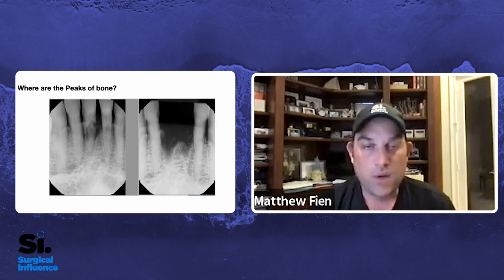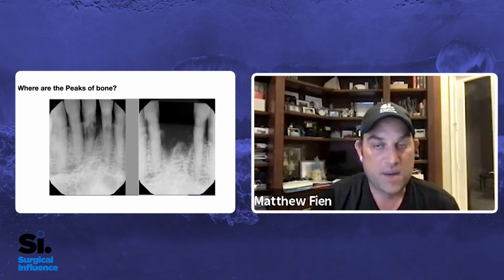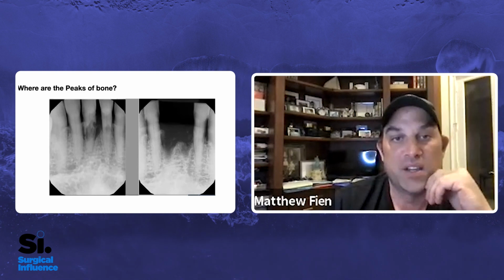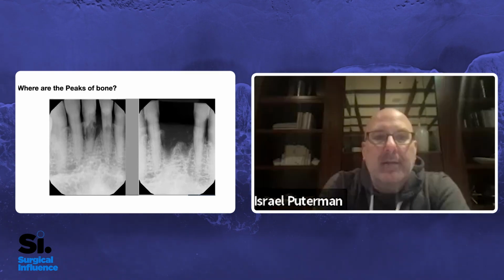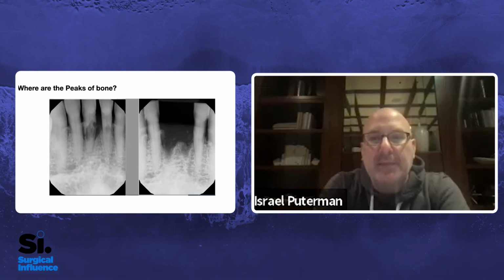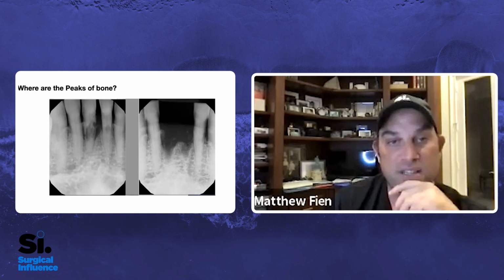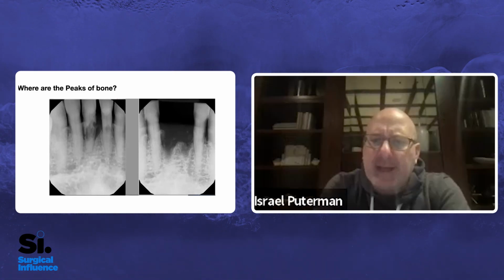What are you looking at here? What are your thoughts on, first of all, the internal resorption? You can see it on both teeth, actually, kind of starting on that number 24. But look where the bone peak is on 24 too. At least in that one view, it looks worse. Yeah. And after the extractions, the bone peak on 26 doesn't look great, but it looks much better on 23 for sure. And look how much soft tissue you can see also. You can see a lot of soft tissue, which you normally don't see on X-ray, but you can almost see the thickness.